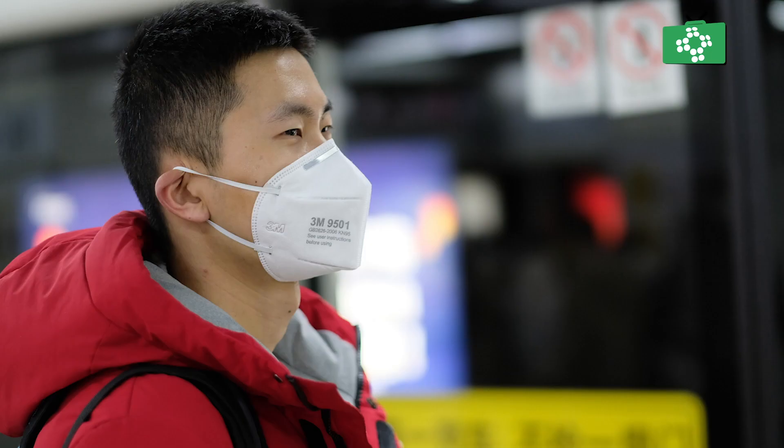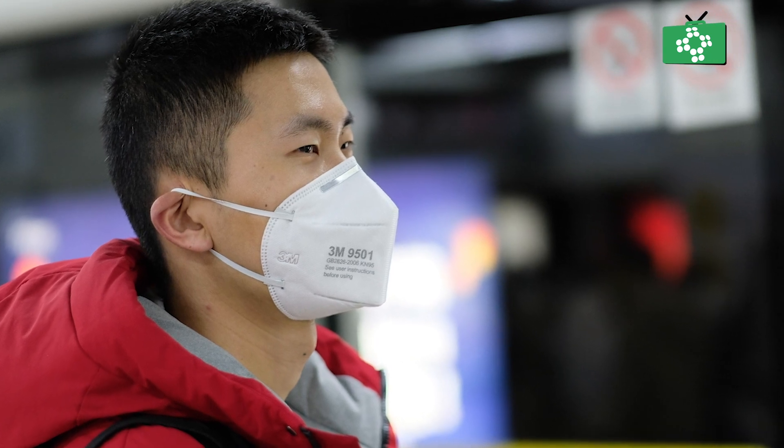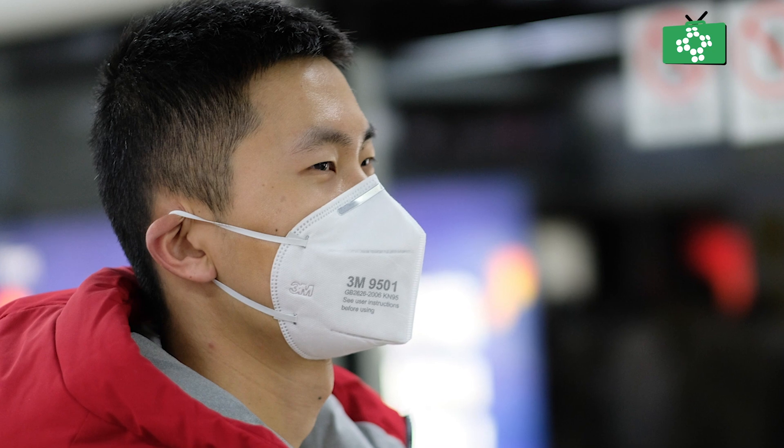The HSE stipulates that FFP3 respirators must comply with British standard. With infection protection for viruses such as COVID-19, the FFP3 will give the best level of protection, although there are of course no guarantees that they will protect you.